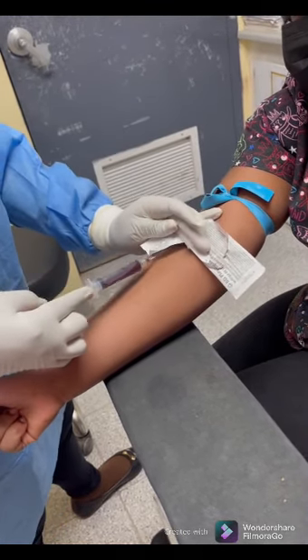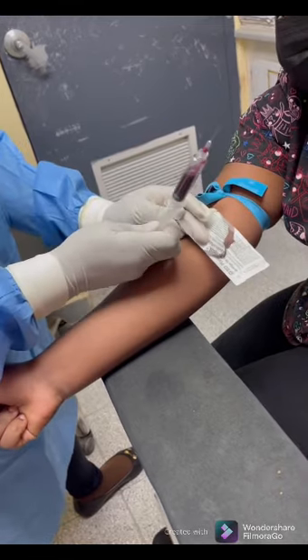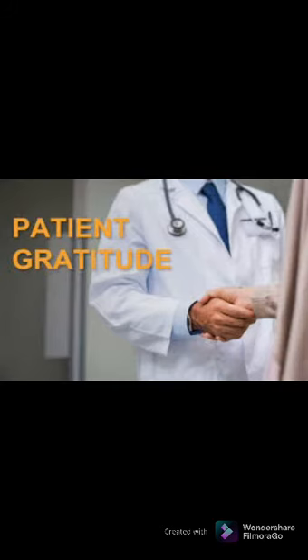Label the tubes, observe special handling instructions, check patient's arm and apply bandage. Dispose of used and contaminated materials, thank patient, remove gloves, sanitize your hands, and transport the specimen to the lab.